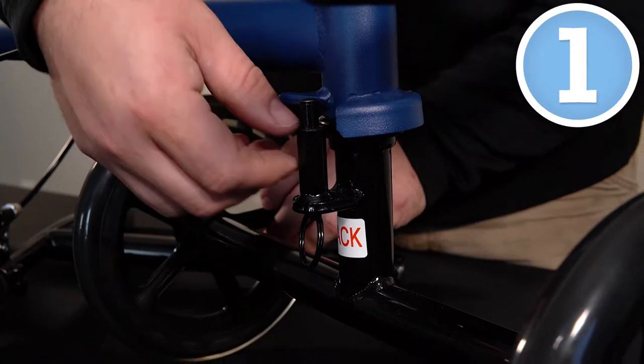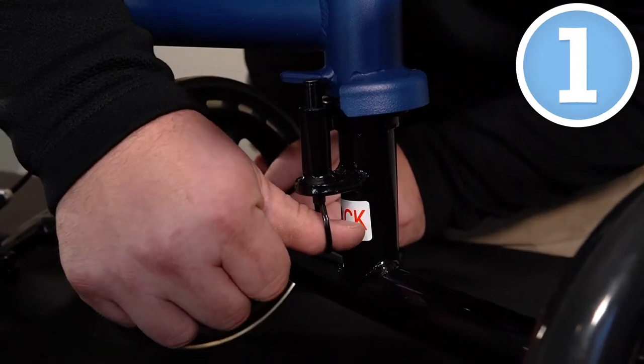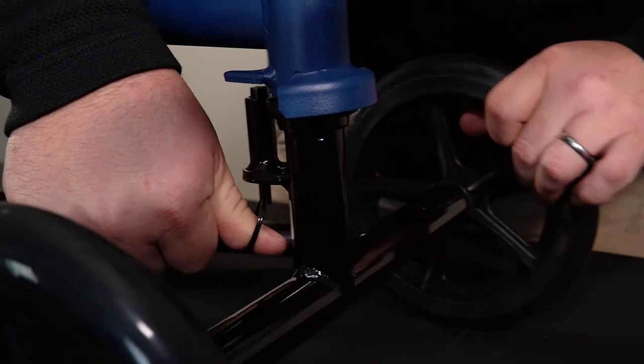Alright, so step number one, we're going to drop this pin down right here, and we're going to rotate this front axle into position.